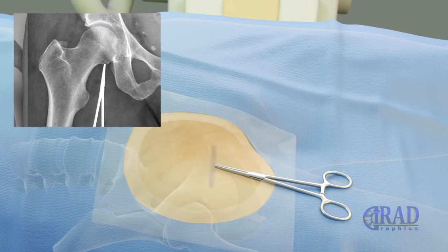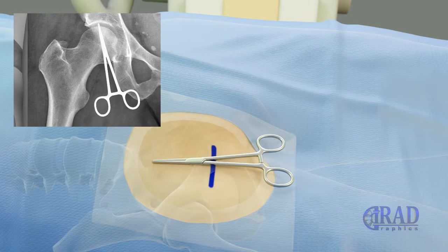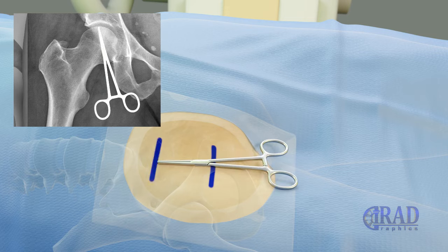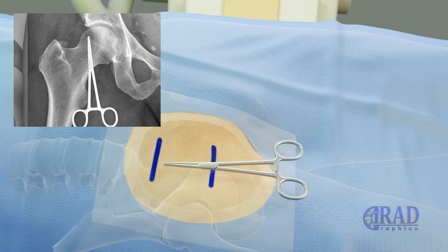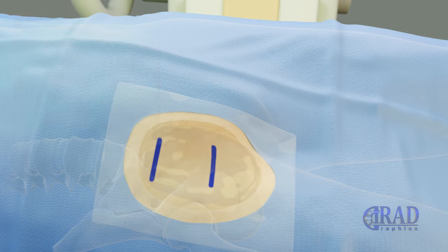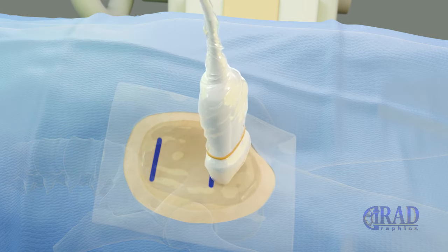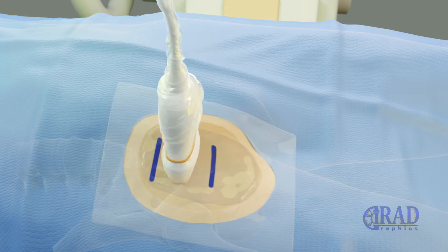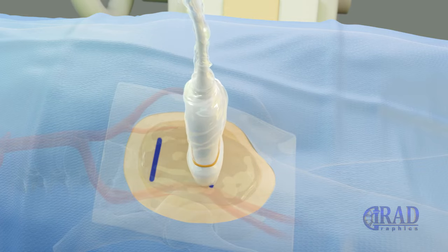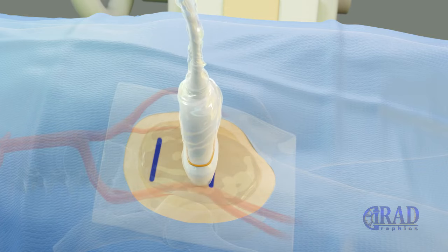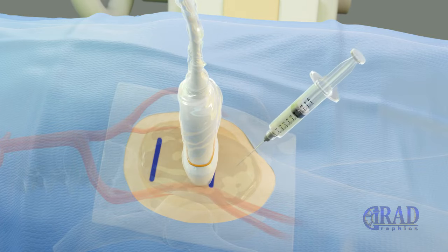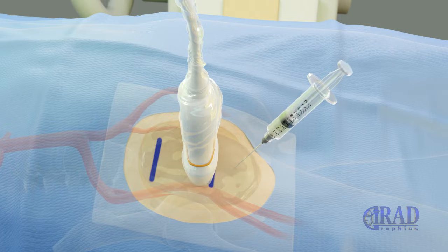As the first step, skin in the right groin area is marked based on the upper and lower margins of the right femoral head. Once the desired location of the common femoral artery for access is picked up under ultrasound, the skin entry site is numbed by injecting lidocaine.